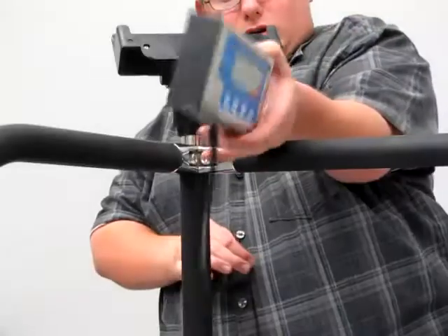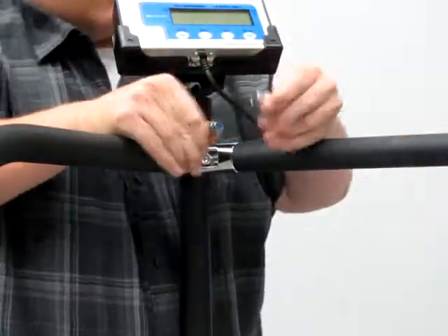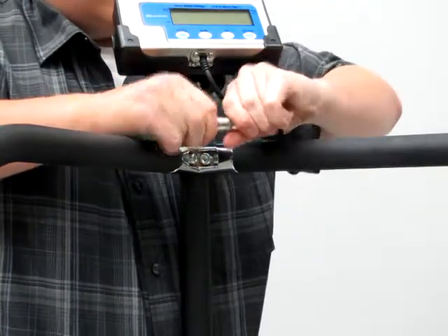Next, place the indicator inside of its holder and carefully connect it to the connector cable, as to not break any of the wires inside the cables and make a bad connection. Then the indicator can be connected to power using an AC adapter.